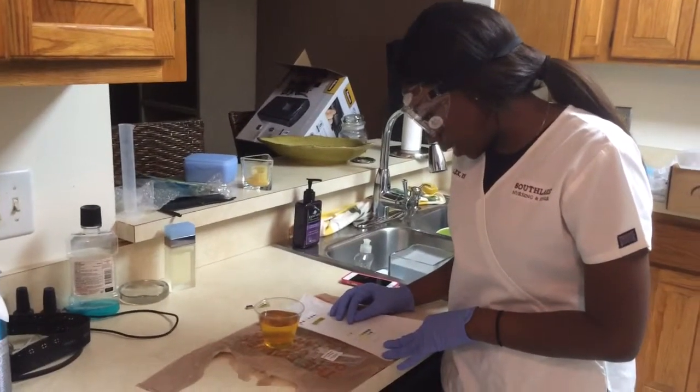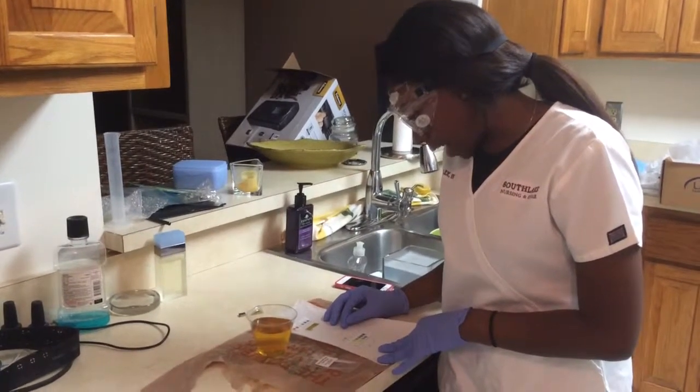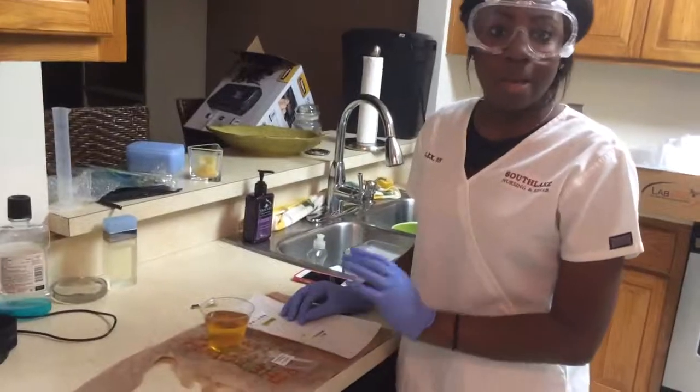As shown here, my glucose level is normal and I have a trace of protein in my urine. And that's my lab.